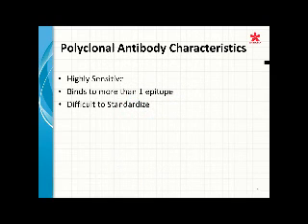So let's start reviewing the different types of antibodies, and we're going to start with polyclonal antibodies. I really want to talk about how it's derived. How do you get a polyclonal antibody? I'm going to break it down. Think as if your blood was drawn from your arm, and an IgG, remembering the subclass of the antibody that's determined by the heavy chain, was isolated from your actual blood and injected into a rabbit.